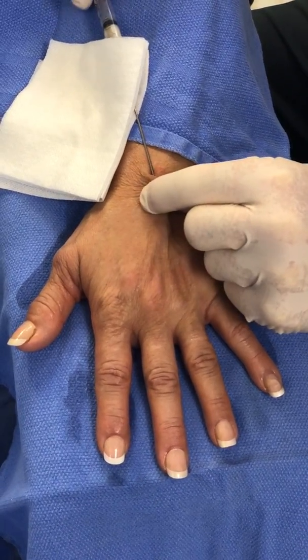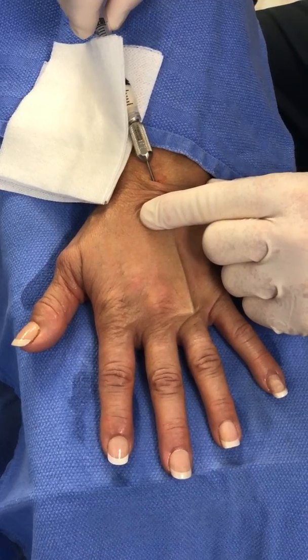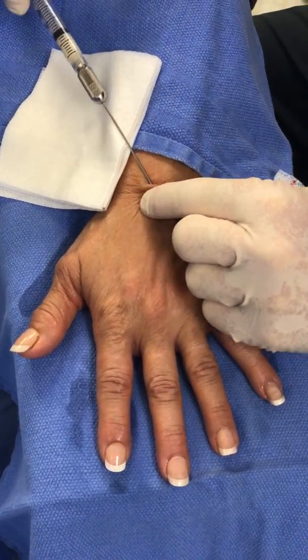How are you doing, Bonnie? Good. And then we'll hit this knuckle pad.